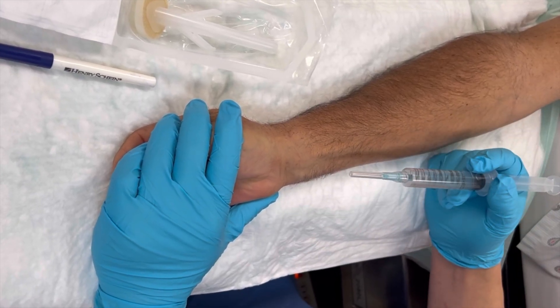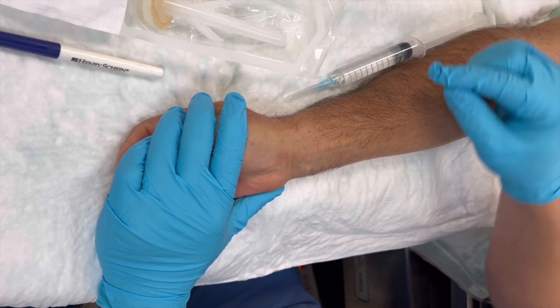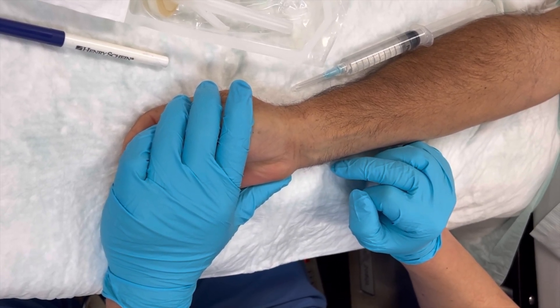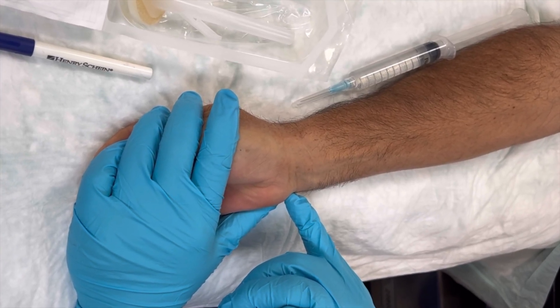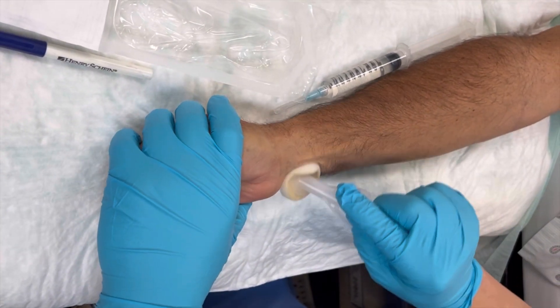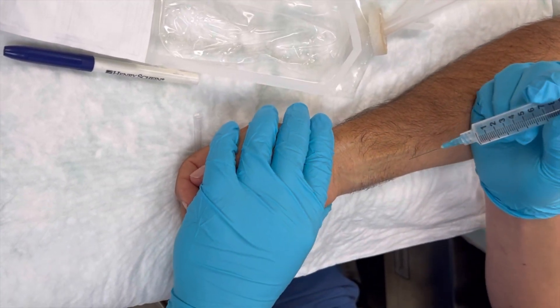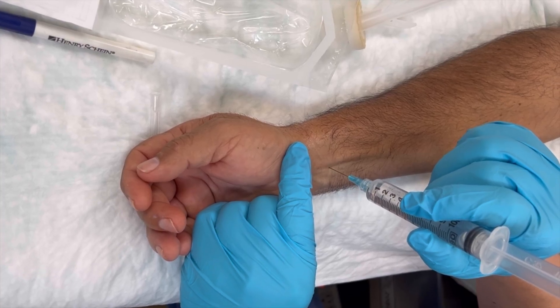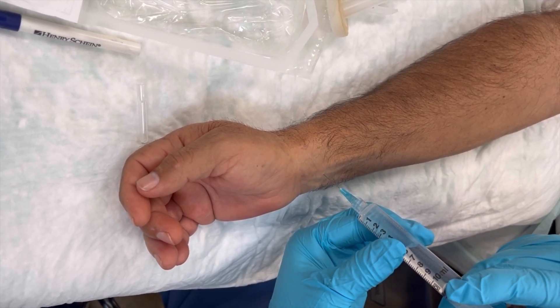Today, I'm going to demonstrate how to do a wrist block. First, I'm going to block the median nerve. The median nerve is located between the two tendons, just underneath the palmaris longus tendon — the PL tendon. This is the wrist flexion crease; it's just about one centimeter above the crease. I'm going to use this to prep the wrist. The needle goes just next to the PL tendon, perpendicular to the skin, and advance slowly. You will feel a pop, then inject 3 to 5cc of local anesthetic.